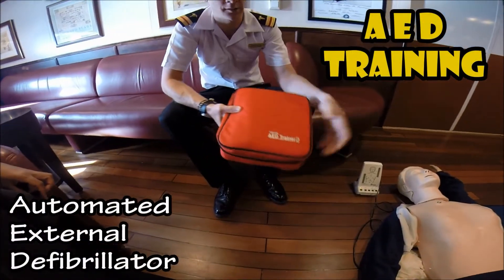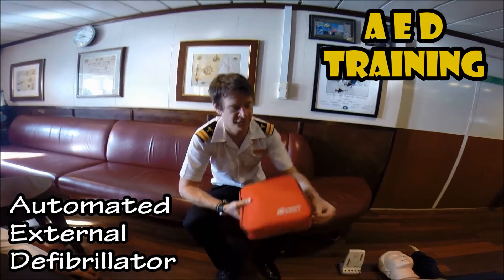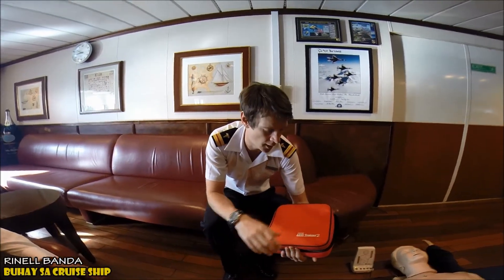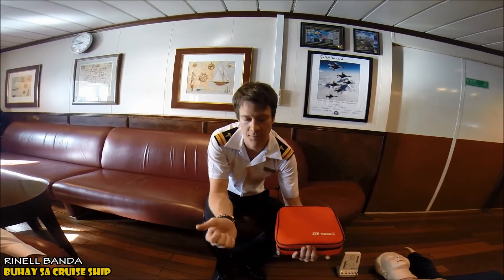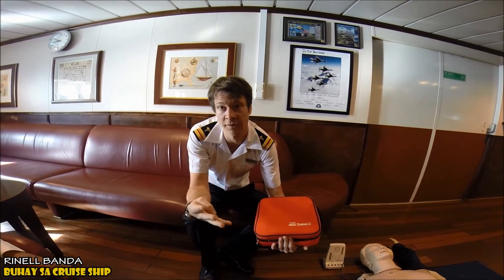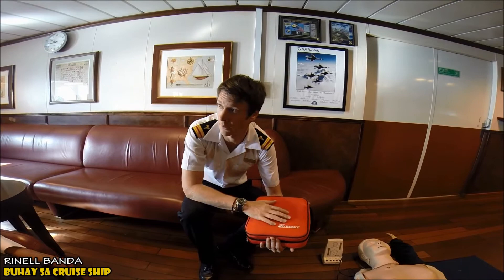AED stands for Automatic External Defibrillator. This is used if a patient has a shockable rhythm to reset their heart and get it pumping again. We have these located in various areas around the ship — at the reception desk, the bridge, the residence gym, the medical center, and at the pool deck.